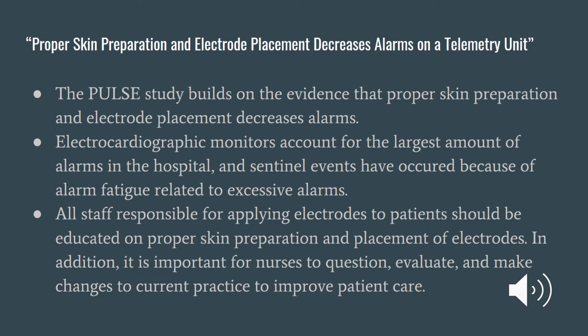The PULSE study builds on the evidence that proper skin preparation and electrode placement decreases alarms. Electrocardiographic monitors account for the largest amount of alarms in the hospital, and sentinel events have occurred because of alarm fatigue related to excessive alarms. All staff responsible for applying electrodes to patients should be educated on proper skin preparation and placement of electrodes. In addition, it is important for nurses to question, evaluate, and make changes to current practice to improve patient care.